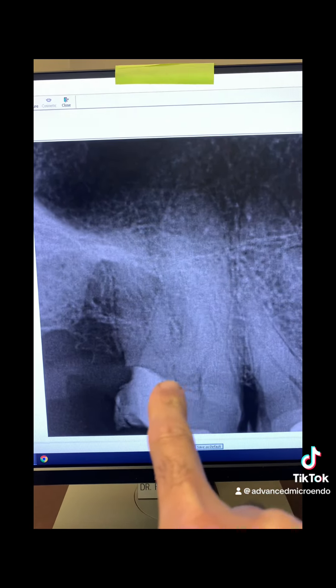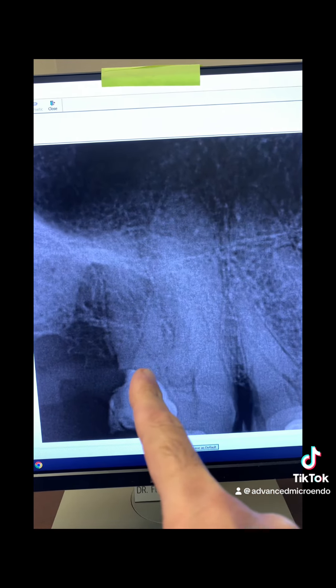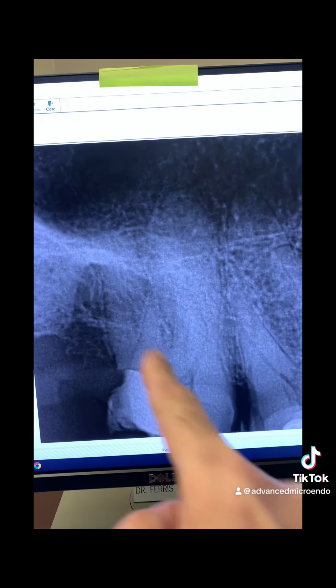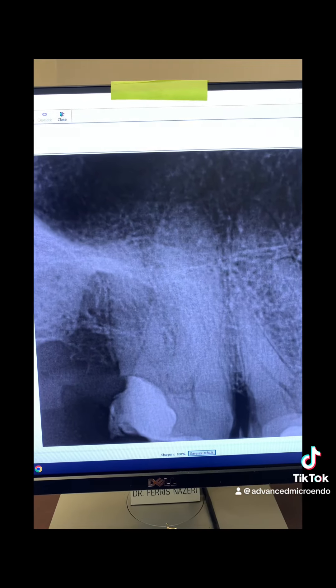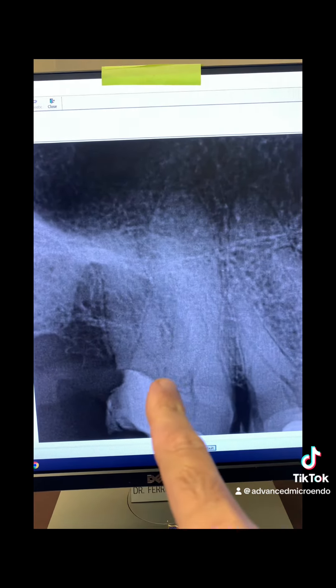Look at all the pulp stone in the pulp chamber there, and the calcification actually extends up the canals. The palatal canal was completely blocked with calcification — like a pulp stone — all the way down. I had to use ultrasonics to remove these tiny pulp stones from the canals, making sure I wasn't blocking myself with them.